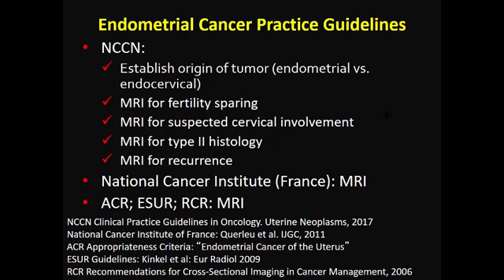Definitely for fertility sparing, and I'm going to show you an example of that. For suspected cervical involvement, as well as for type 2 histology, so serous papillary and clear cell carcinomas, you can use it for staging, and of course for recurrence.